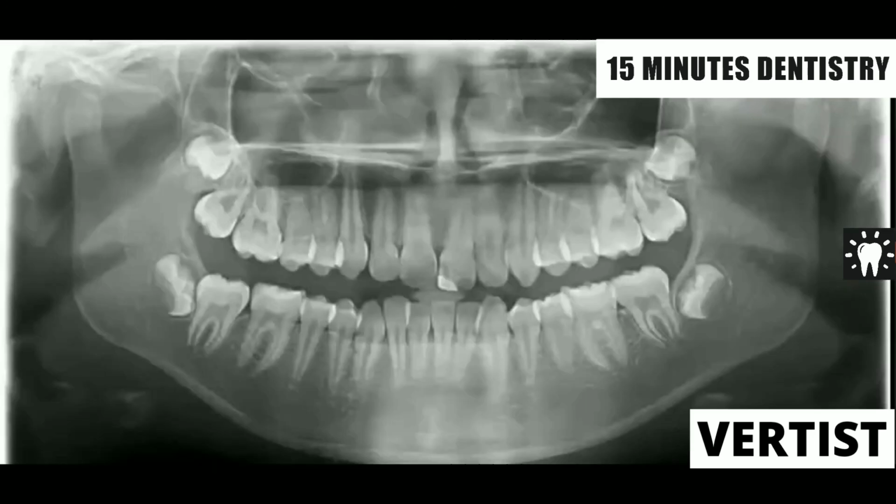This is the OPG, which is indicated for any extraoral pathology. Maybe a fracture, a benign tumor, a malignancy, TM joint diseases, developmental anomalies, congenital anomalies. In pedo patients to see the eruption of the teeth, in orthodontics to see the malocclusion, or n number of uses. This is a routine radiographic technique you might have seen in your institution, from the right side condyle up to the left side condyle, everything you can see. So we call it a panoramic view.